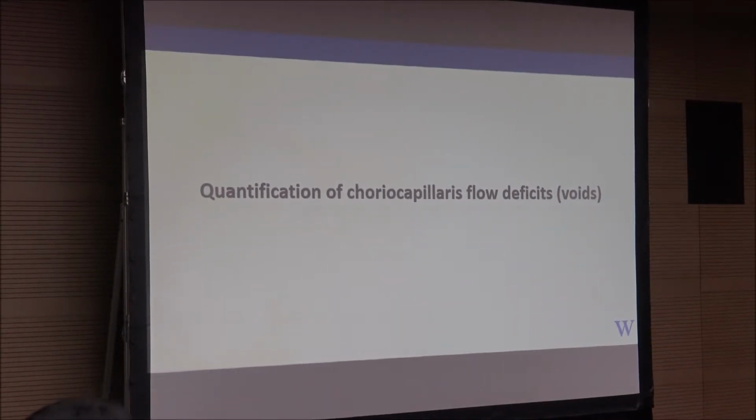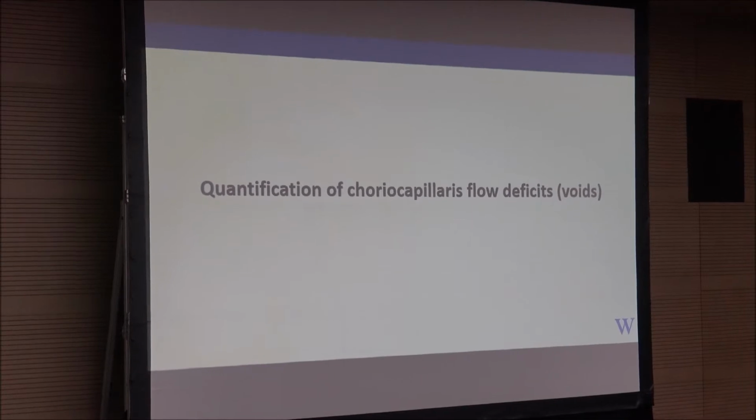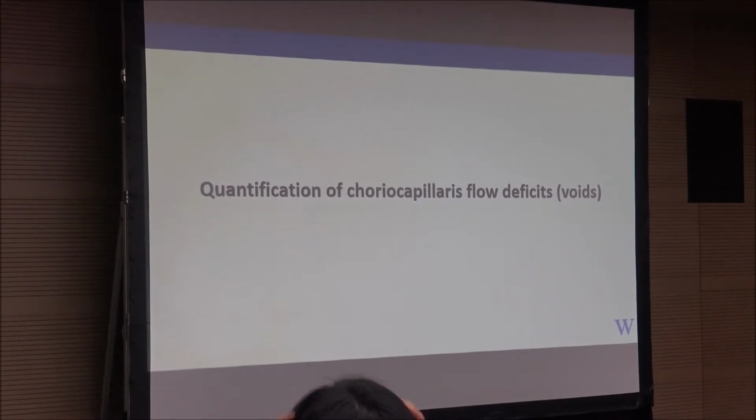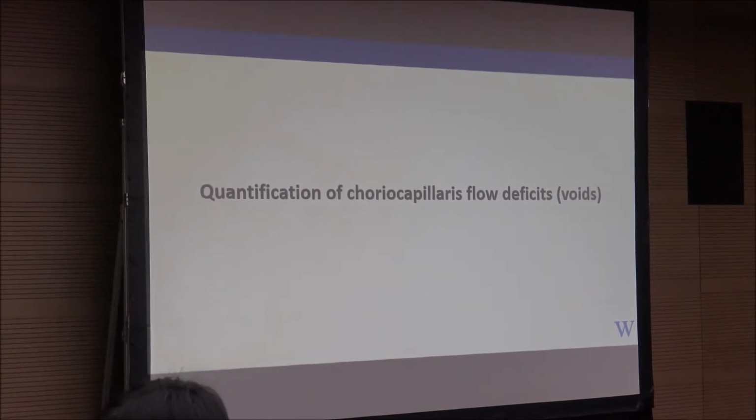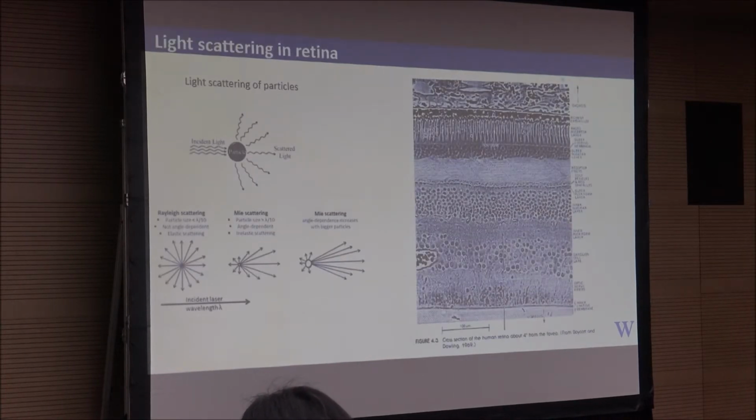I think lots of people want to quantify the choriocapillaris. Nowadays you have a spectral domain OCT system to look at the angiograms. A spectral domain OCT uses the shorter wavelengths. That shorter wavelength has very high scattering to the RPE layer, so that high scattering will stop you from visualizing the choriocapillaris. And so this is the physics. I will just ignore the physics over here.